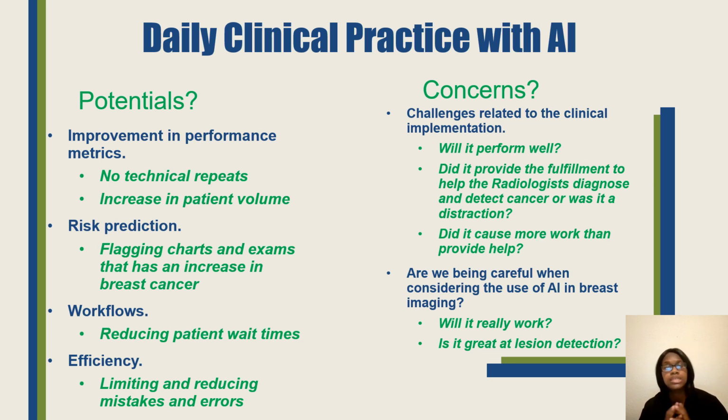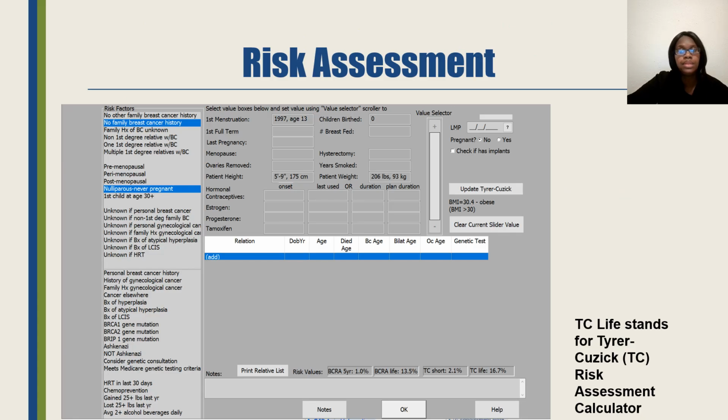Then you have some concerns. Will it perform? Will it cause more work than it provides help? Will it help the radiologist diagnose and detect breast cancer? Will it really work? Is it great for lesion detection? So you do have those concerns with AI.